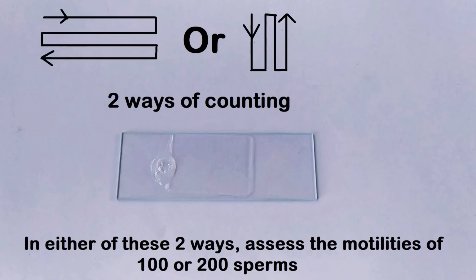100 or 200 random sperm cells are briefly observed one by one to check for motility or the lack thereof. To minimize the chances of repeated assessment of the same sperm cell for motility, the microscopic field of view is changed frequently in a specific order of movement, such as from the left corner of the slide to the right corner, until 100 or 200 cells have been assessed.